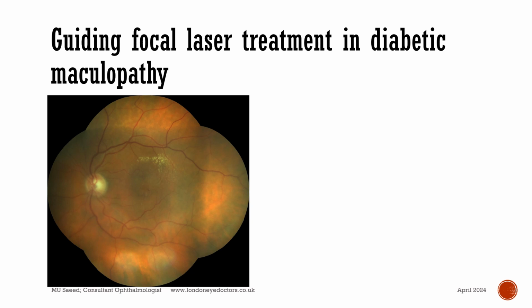In certain patients, diabetic retinopathy and diabetic maculopathy can be guided by having an OCT, and patients who are about to undergo laser treatment sometimes would benefit from having an OCT scan.